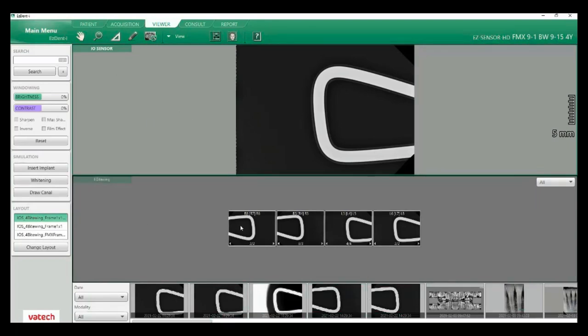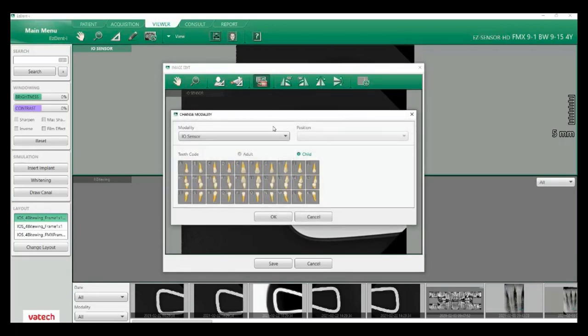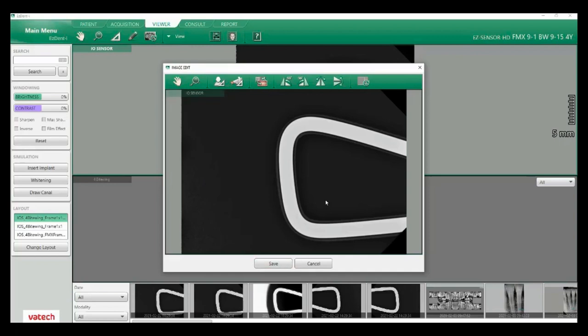Let's talk more about viewing our images. I can right-click on my image — if I need to edit the image, this will allow me to flip it. It will also allow me to assign the tooth number. Let's say I've taken the image in the wrong tile — I can come here to IO sensor, click on adult, click on the tooth itself, and reassign the number there. You can also change between adult and child. Once you do that, it will automatically assign to that tooth number and tile.